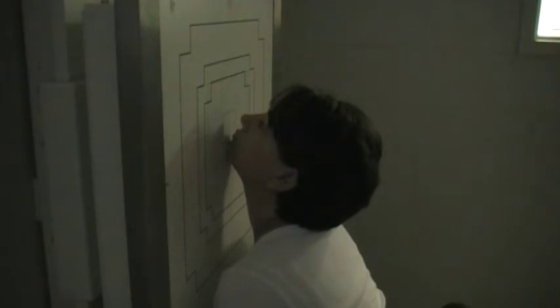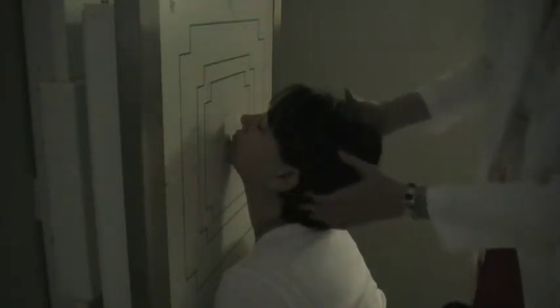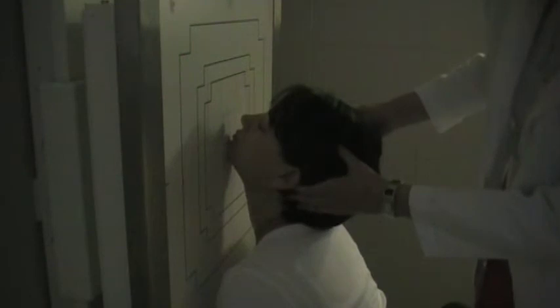Just check your midsagittal line. You can also check using a protractor — your orbital meatal line should form an angle of 37 degrees with the board; that's another way of checking it. You can also check your mentol line, which is usually pretty much perpendicular to the board.